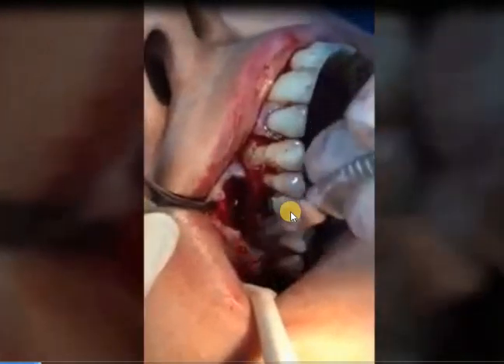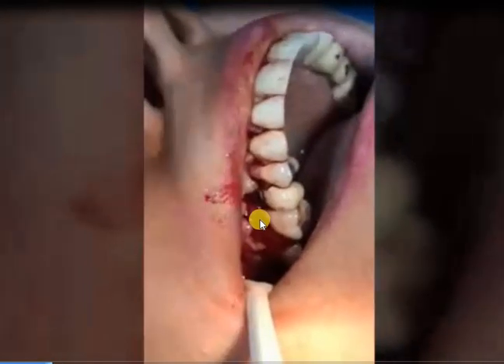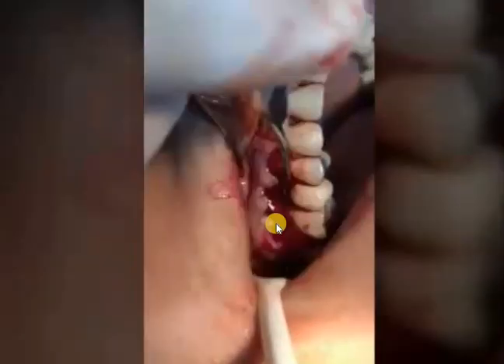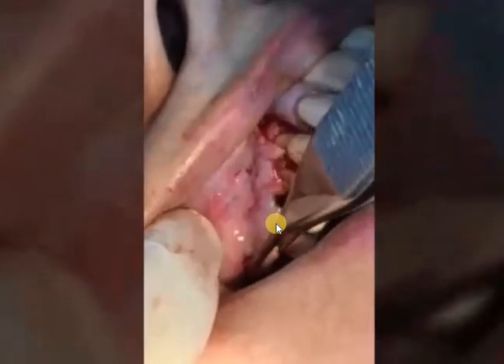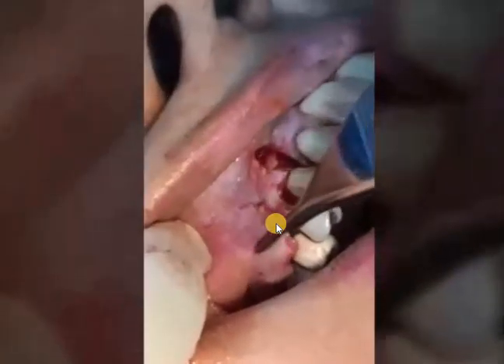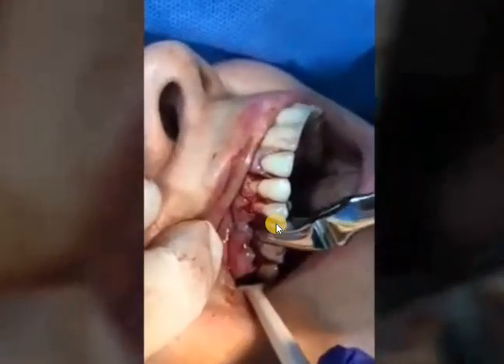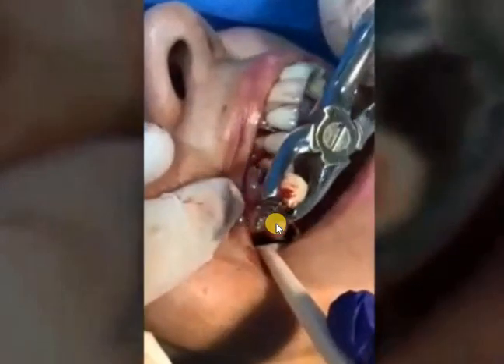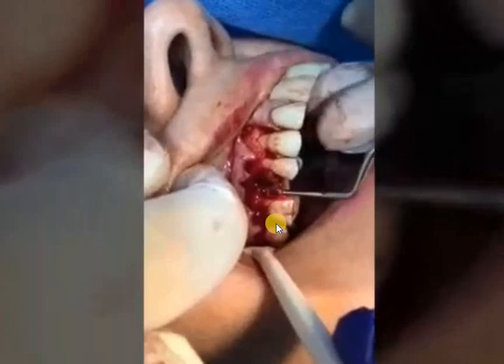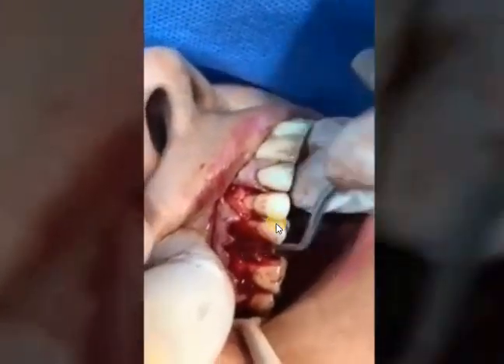This space is needed to cover the implant surface after placement. Without creating this release, when you place bone graft and soft tissue — whether autogenous or xenograft — you will end up with tearing or excessive tension on the flap. By making part of the flap full thickness and the other part partial thickness with muscle release, you can cover the excess materials placed on the surface.